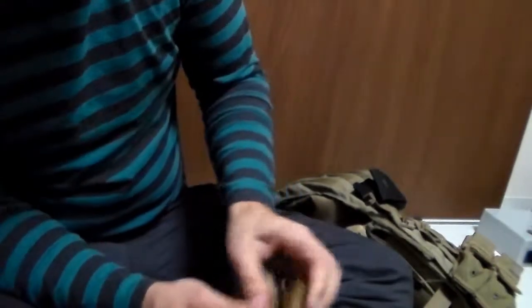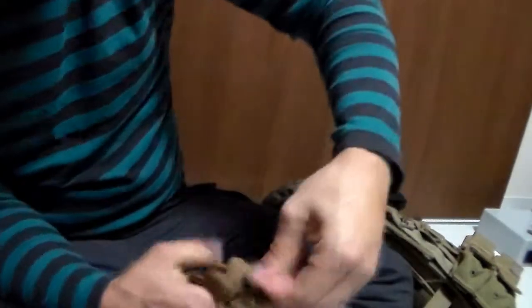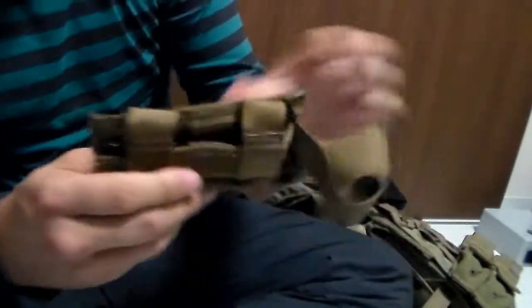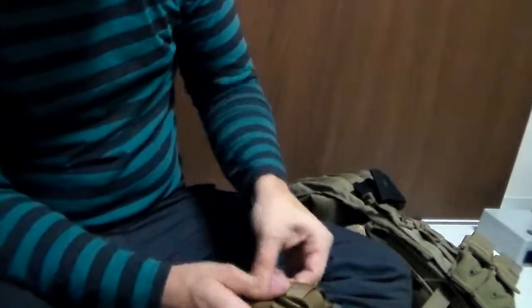Much easier than it looks. And then you just clip it to the back end — it'll hold sideways as well. Neat little feature. I liked it. Right now I'm keeping them clipped down.